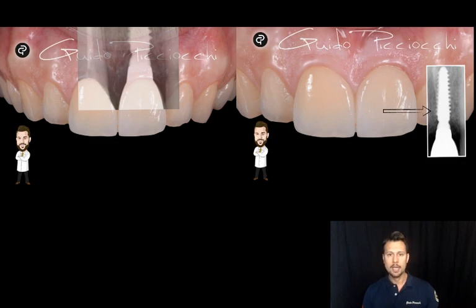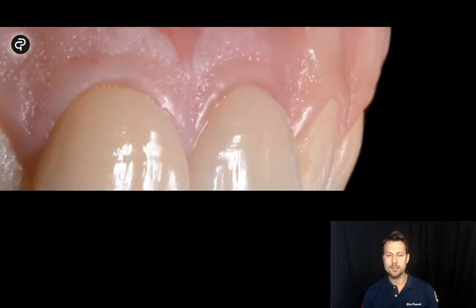But what I love the most, as I told you, is the soft tissue integration, because in this view, having just a bone grafting and not a connective tissue grafting, not having a part of the root to perform the root membrane technique, what is impressive is the stability and the complex between the implant and the natural tooth that look almost the same. And why?